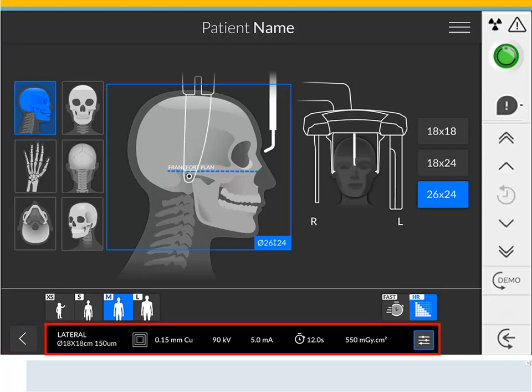Exposure Parameter Panel: This option enables the user to choose and save exposure parameters for the radiological image acquisition. Imaging Mode enables the user to select the desired resolution before doing an exam — fast or high resolution.